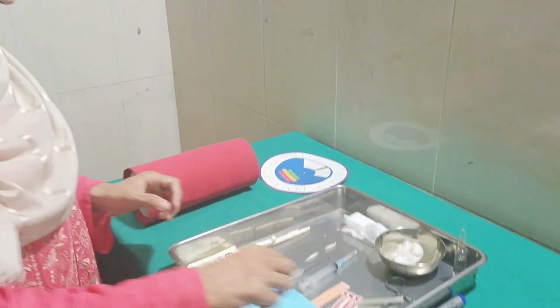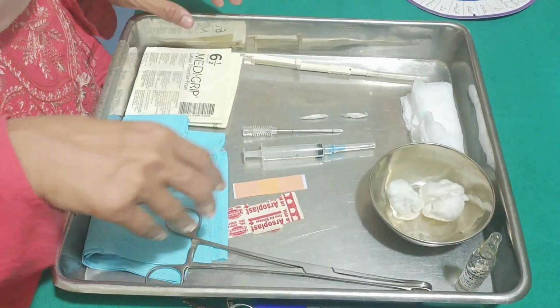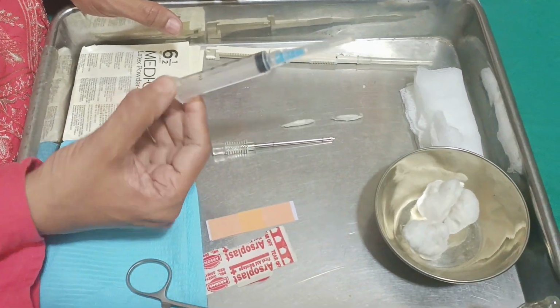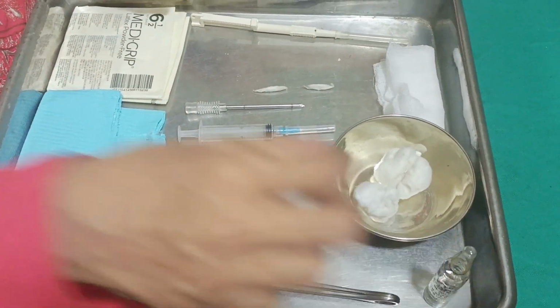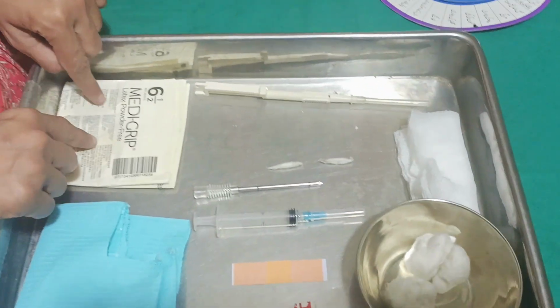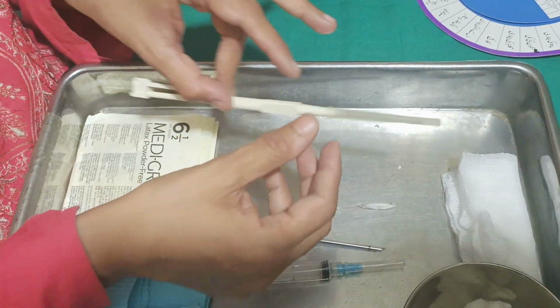So first of all, what are the things required for the insertion of Implanon? Obviously, this is the sponge holding forceps. This is the small metallic bowl, which has the iodine swabs. There should be a 2 cc syringe for the anesthetic infiltration. There should be 1% lignocaine. There should be a 12 by 12 centimeter sheet with a hole in the center. And there should be a band-aid and sterilized gloves. And this is a Jadelle, which I have already told you about, with the plunger and the trocar. And this is the Implanon with the needle sheath.